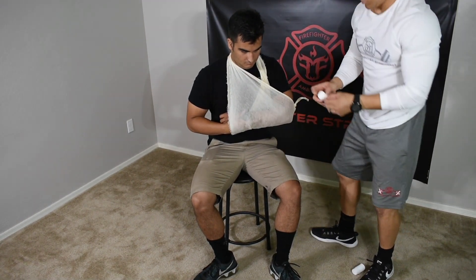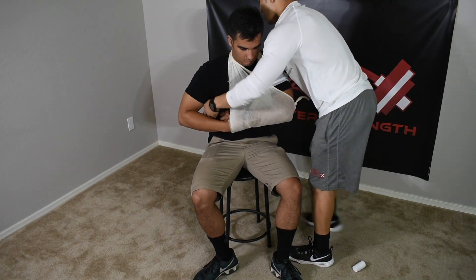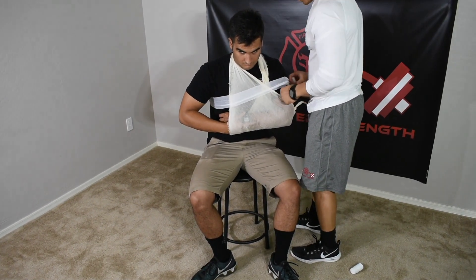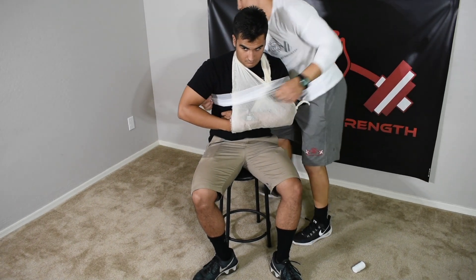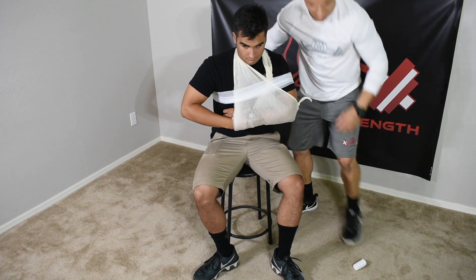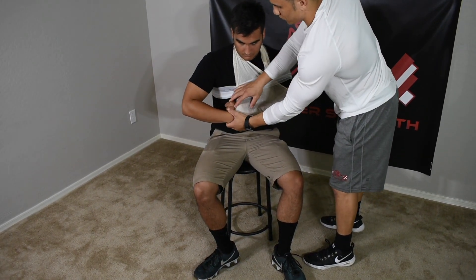Take this clean, slough out of it. All right, sir, I'm going to put this in the hand here. Hold it into position and function.